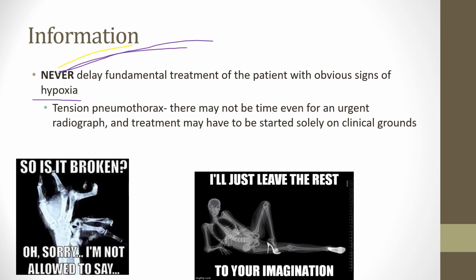Now, if the patient's stable and all this other stuff, and they don't have terrible sats, they don't have a bad blood pressure, they don't have anything like that going on, then maybe a diagnostic X-ray. But overall, they're going to want to know, if you know that there's a pneumothorax, are you going to wait to treat it while this patient dies in front of you, or are you going to treat the patient for a condition that you know they most likely have? And that's what they're trying to go for. Like I said, this is an NBRC thing. Sorry, a board exam thing.